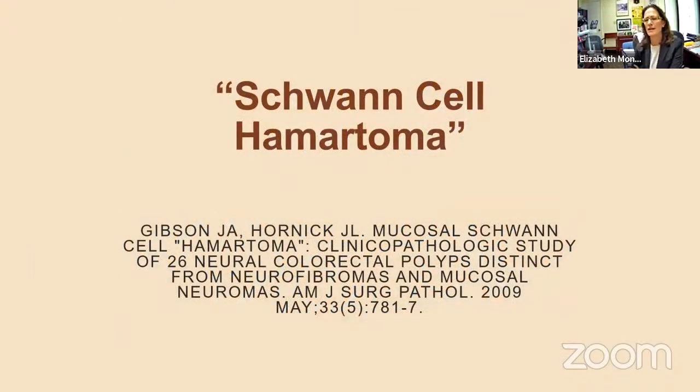Something you'll see not infrequently is a lesion that Jason Hornick and his colleague, Dr. Gibson, I think her name is Joanna, called Schwann cell hamartoma. Please, if you're Dr. Gibson, don't smack me. They're not exactly hamartomas, but I believe the authors use this terminology to separate them from mucosal neuromas, which can be quite clinically significant.